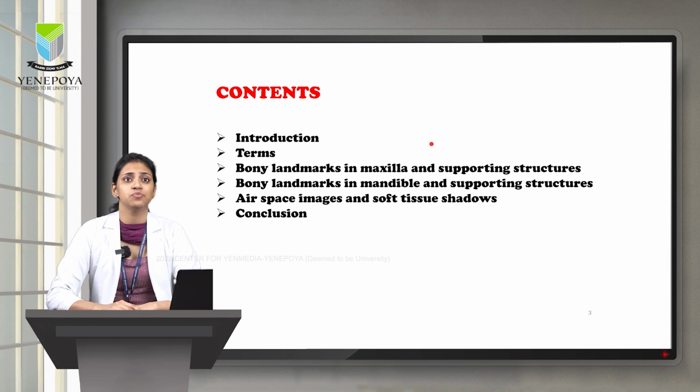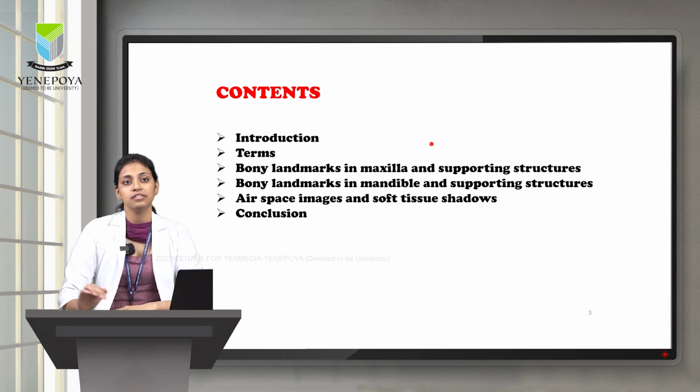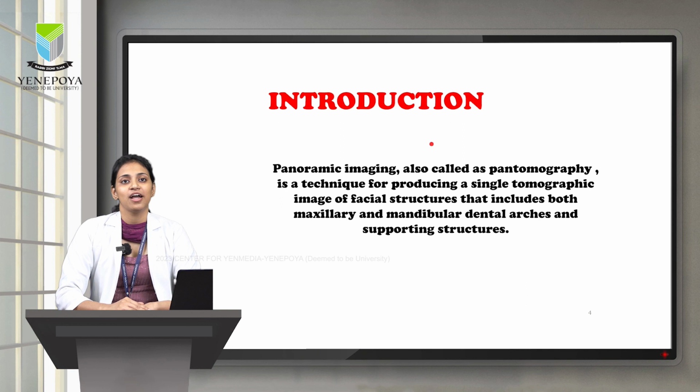Contents of this presentation will include a brief introduction followed by some terms which are commonly used throughout the presentation, and then bony landmarks of maxilla and its supporting structures, bony landmarks in mandible and supporting structures, few air spaces and soft tissue shadows, and followed by conclusion.